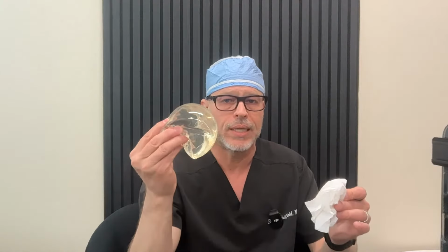The second reason is, if the shell of the implant is losing particulate matter, small little pieces of it come off into the tissues, your body recognizes that as foreign, and then it wants to respond to it and get it out of your body. So it's a constant signal back to your body to tell your body, like, hey, we need to get rid of this. So there's bacterial contamination, there's potential interaction from the immune system by leaving the scar tissue in there.